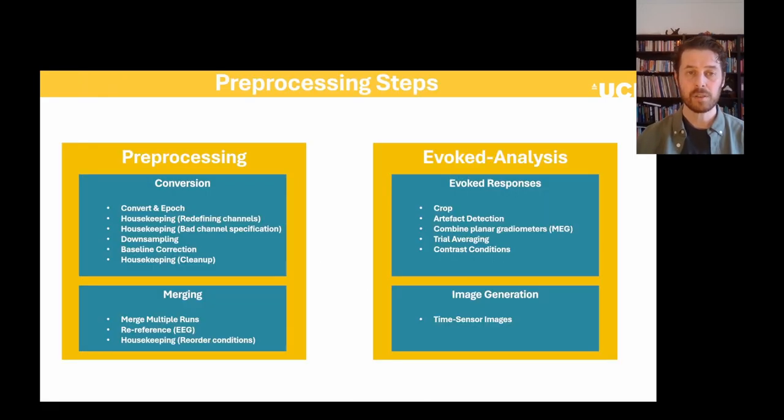Okay, so let's touch upon the pre-processing that we're going to do. I've broken this down into two main themes. The first is concerned with pre-processing, in which we're trying to amplify the SNR of our data, and then preparation of our data to do evoked analysis, where we're looking for effects in our data as a function of peristimulus time.